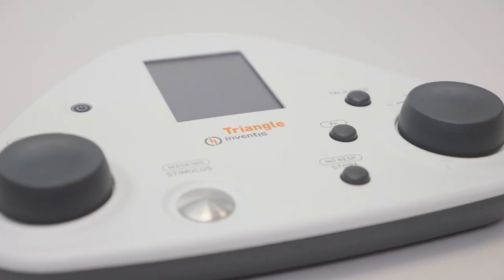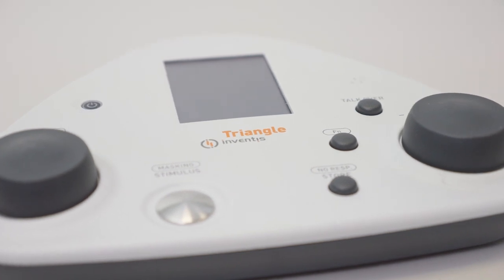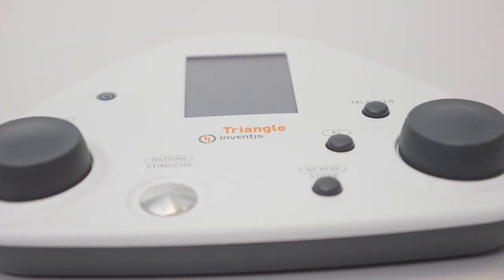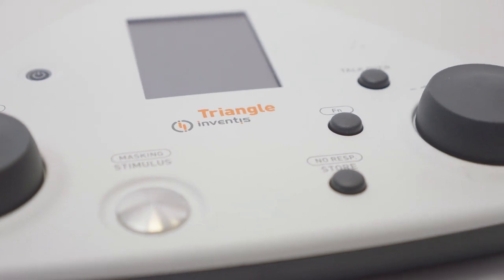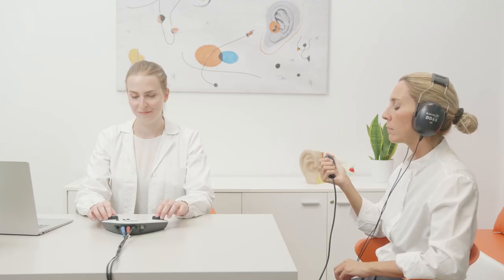Triangle is a portable screening audiometry device capable of performing pure tone audiometry exams in air conduction and, upon optional license activation, also in bone conduction. Thanks to its lightweight and compact design, Triangle is a perfect solution for private practitioners on the move and occupational health professionals.